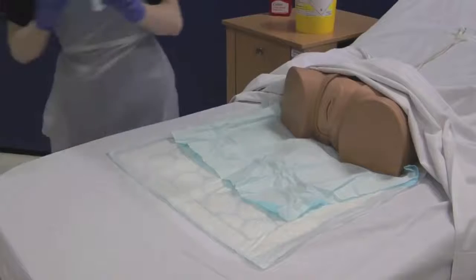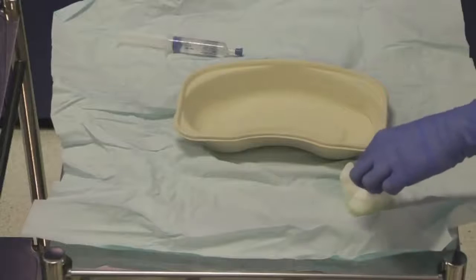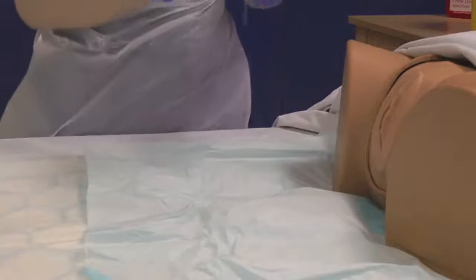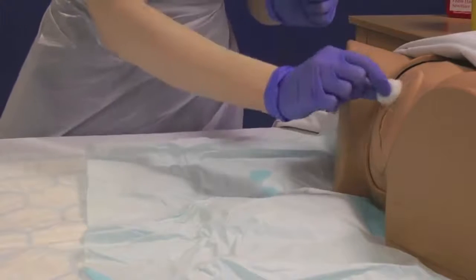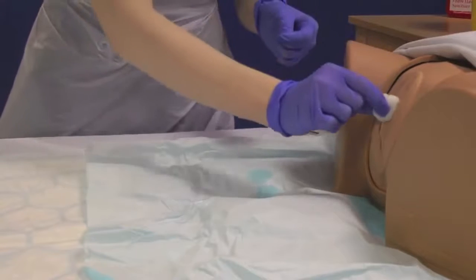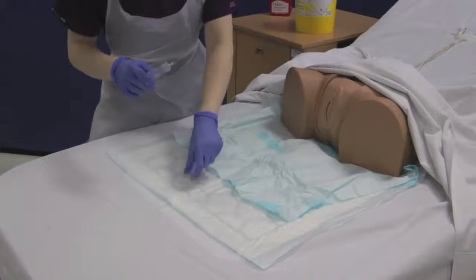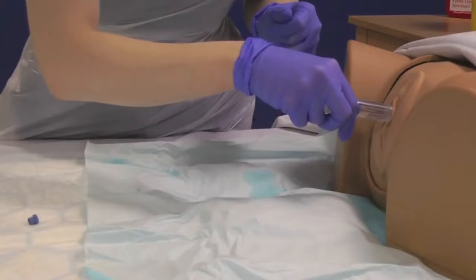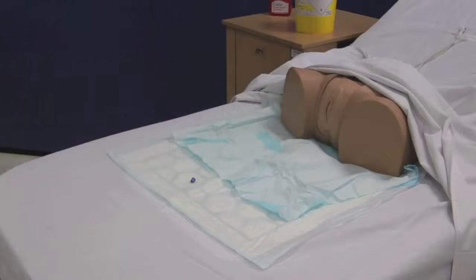It may be necessary to part the labia at this point using the sterile swabs. UHL policy utilises a clean hand dirty hand technique as demonstrated here. Use your clean hand to pick up the sterile cotton wool balls and pass them to your dirty hand. This ensures that your sterile field is not contaminated. A dirty hand is the only hand that touches the genitalia. Use a minimum of five cotton wool balls, cleaning from front to back symmetrically from outside to in. Once you have finished cleaning the genitalia, take your Instilagel and insert only six millilitres into the urethra. Dispose of the syringe into the sharps bin and allow five minutes for the gel to take effect.